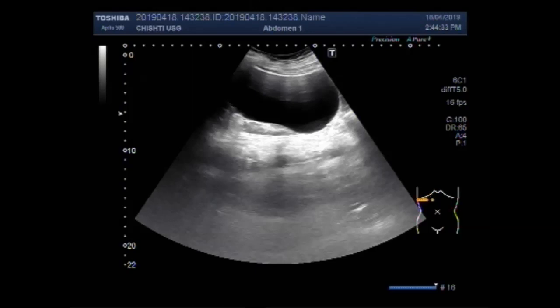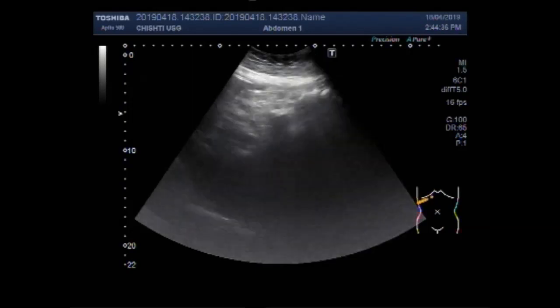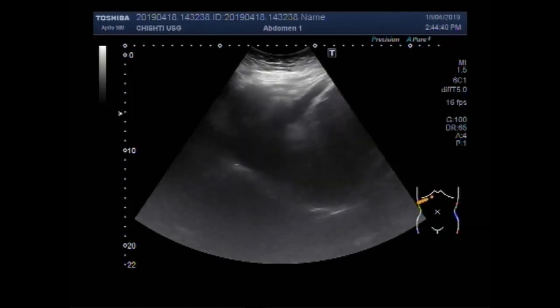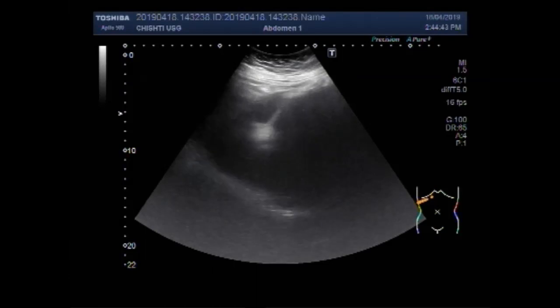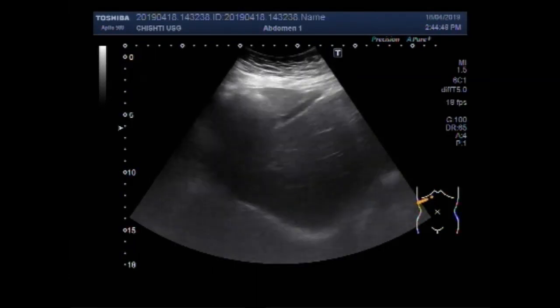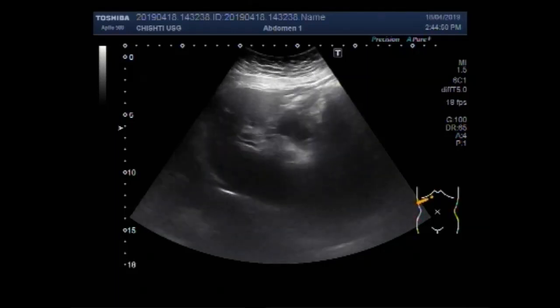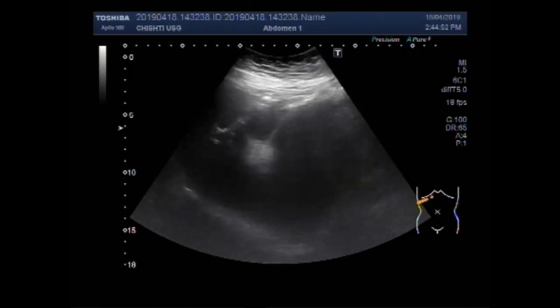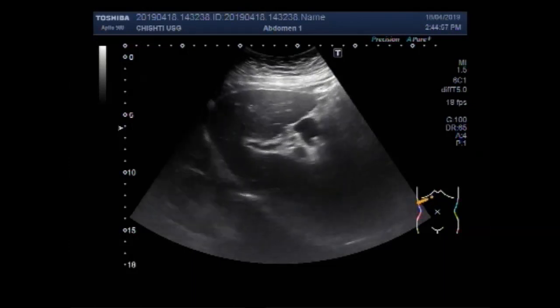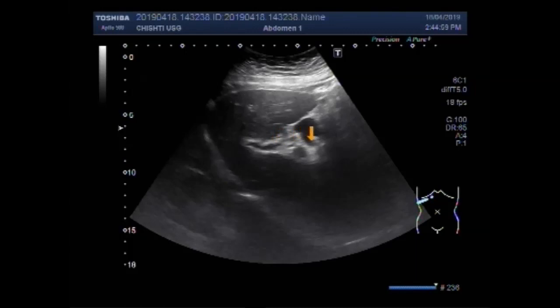Now you will see the gallbladder stones when the patient is in the supine position. The patient is about 65 years old, a lady. You can see the liver and gallbladder — these are the gallbladder stones.